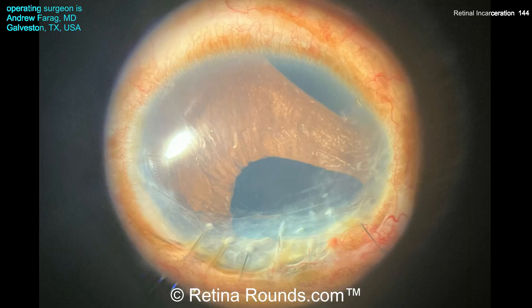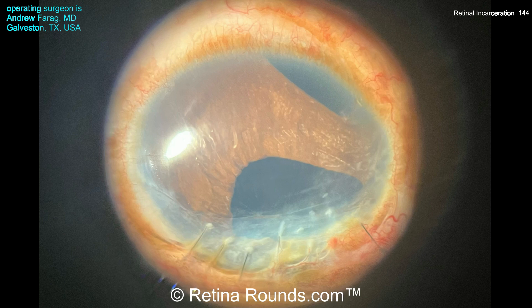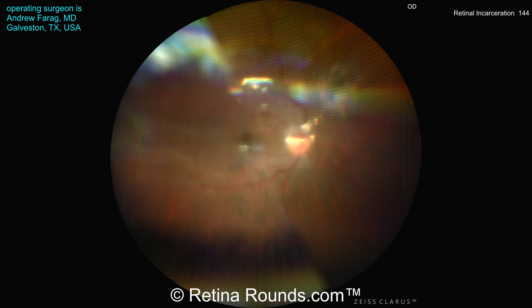At postoperative month 2, the patient's vision is counting fingers and intraocular pressure is 18. The fundus photo shows the retina is completely attached. If it remains attached, the patient will be scheduled for silicone oil removal and anterior segment reconstruction in the future.